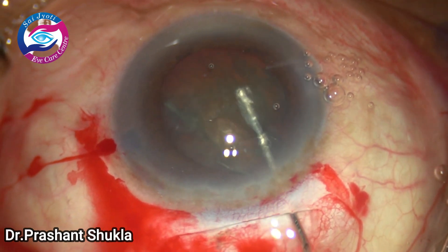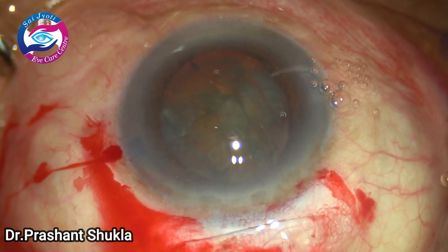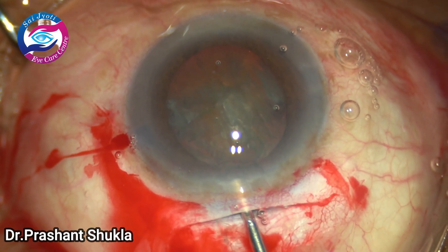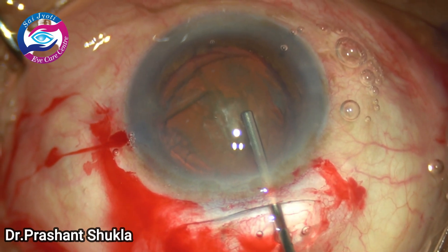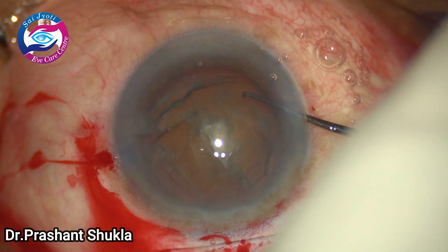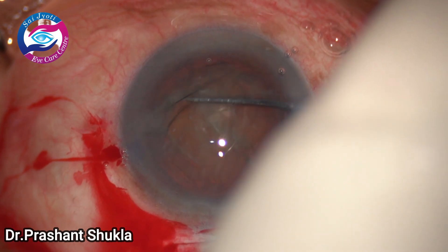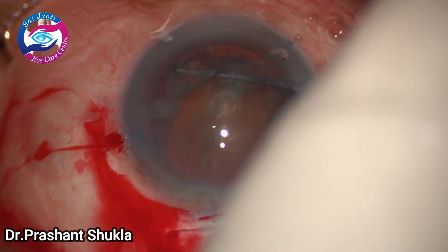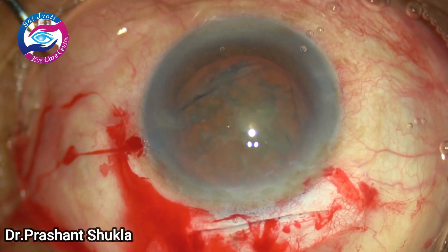Some viscoelastic is instilled and now I am going to use a Sinskey hook to check the mobility of the nucleus. Once the mobility of the nucleus is confirmed, this means we have achieved a very good hydrodissection and all the cortico-capsular adhesions have been released.